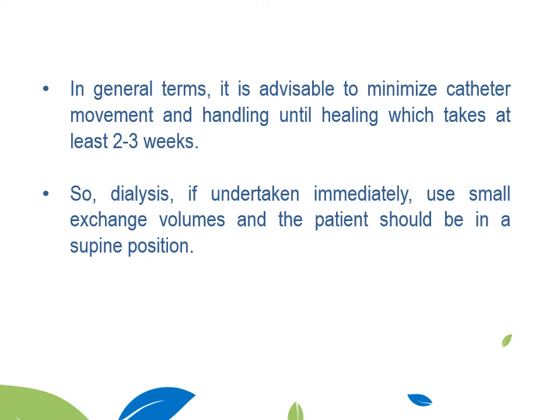In general terms, it's advisable to minimize the movement of the catheter and handling until healing takes place. Actually, when you insert a PD catheter, you should keep it in place without usage. We call it the break-in period, for 2 to 3 weeks, not less than 2 weeks. Below 2 weeks, you will have many complications, especially leakage, which will lead to further delay of the start of the PD.